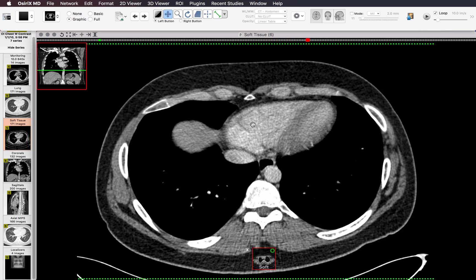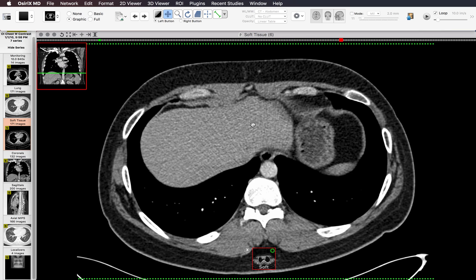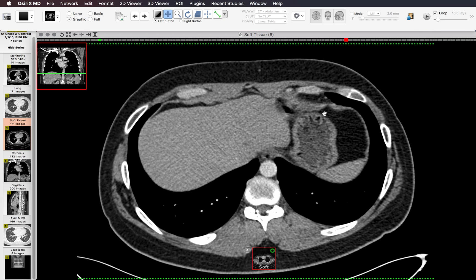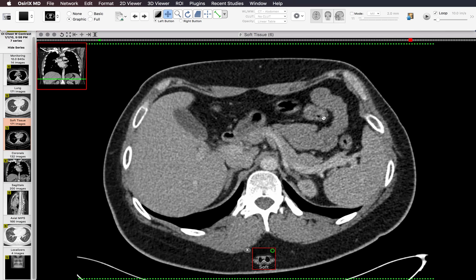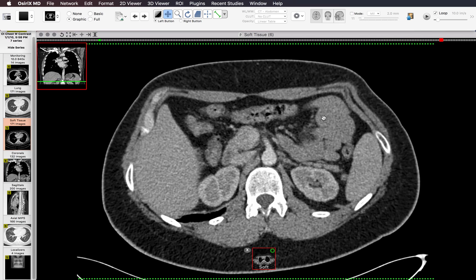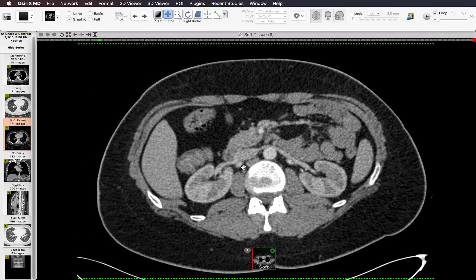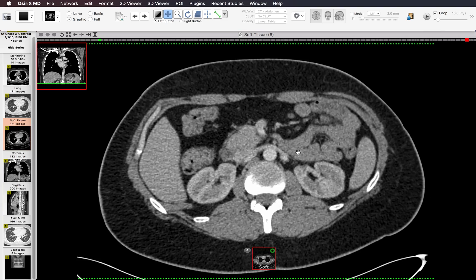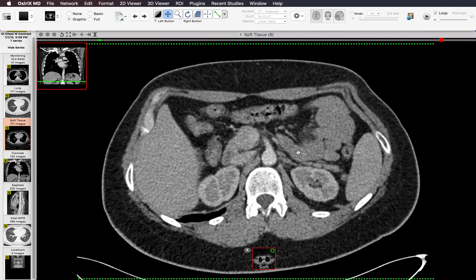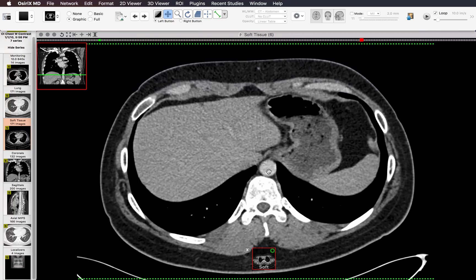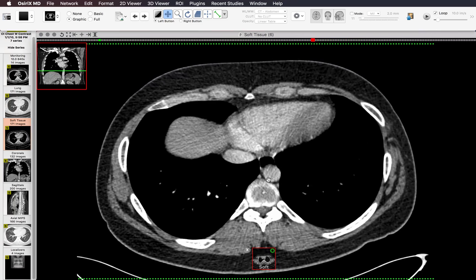Then I scroll down and look at the lymph nodes in the anterior diaphragmatic region, where I do use a 10 millimeter cutoff. Then I go all the way down to the last image and look at the area around the aorta and the esophagus — the paraesophageal and paraaortic regions — looking for lymph nodes.